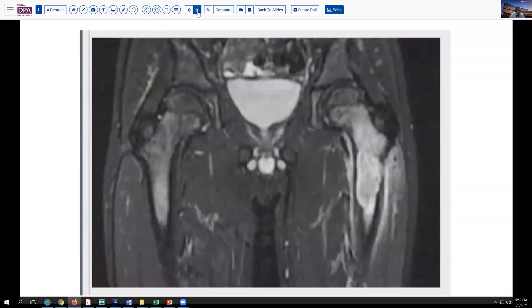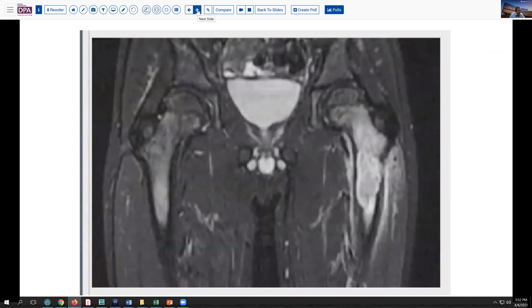Looking at it on the coronal view, we can see that it extends down the marrow quite a ways with brightness. It does spare the epiphyses, both in the greater trochanter and in the femoral head. But the degree of involvement here is fairly significant at this stage, and comparing laterality, you can see the findings quite easily.